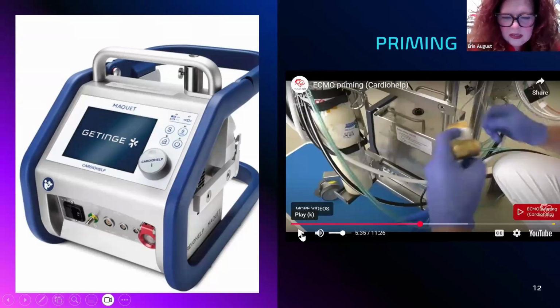Working along with the nurse at the bedside, if we see that our temperature is overriding, ask: does my patient have a temperature? Do they have a fever? Have you given Tylenol or something to address the fever? And then on my side, walking through the steps where I teach the staff in the wet lab, what would be the first thing you do? Well, you pop the lid and dissipate the heat. Two, if that doesn't work, then I can start dropping my temperature. If that doesn't work, then I can add ice.